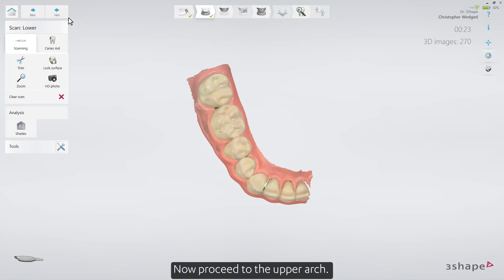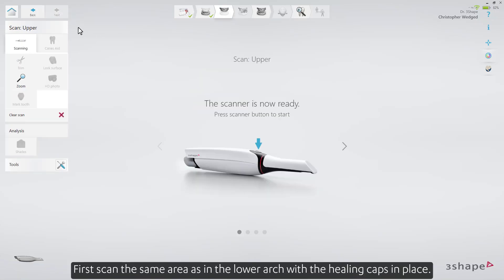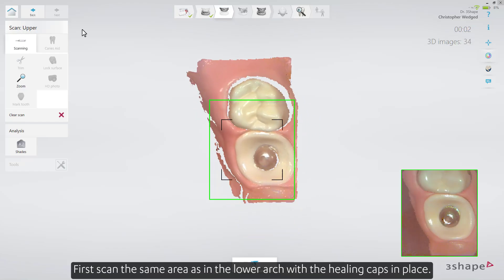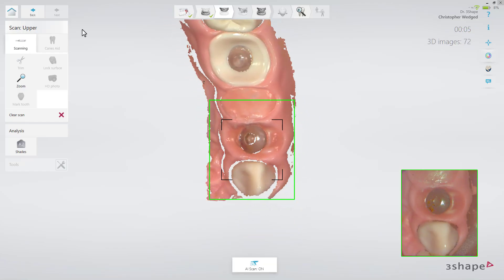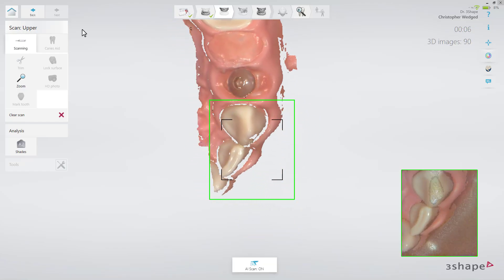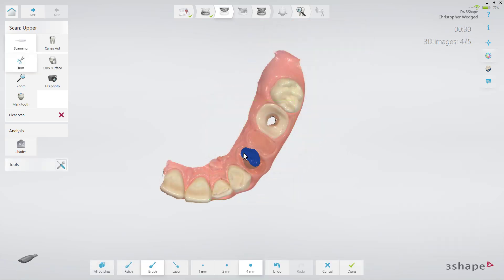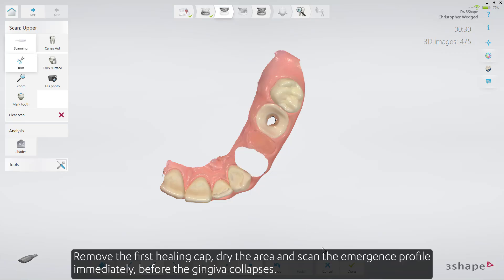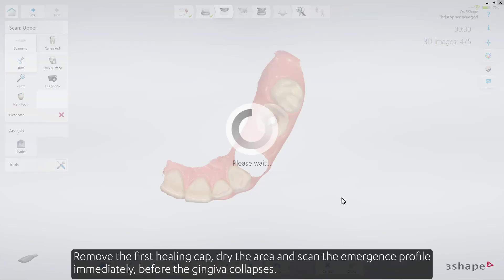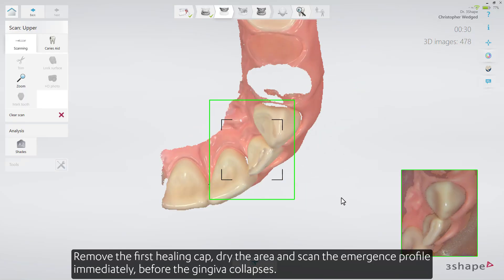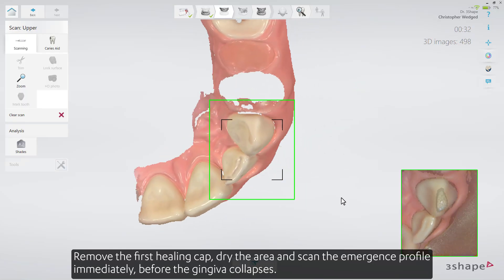Now proceed to the upper arch. First, scan the same area as in the lower arch with the Healing Caps in place. Then trim away the Healing Caps in the scan. Remove the first Healing Cap, dry the area and scan the Emergence Profile immediately, before the gingiva collapses.